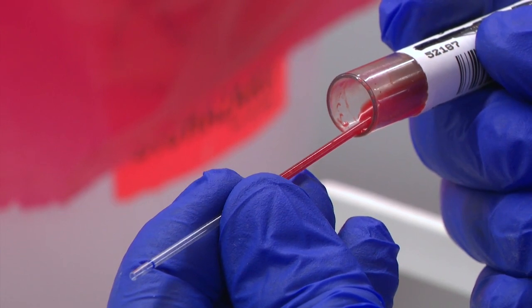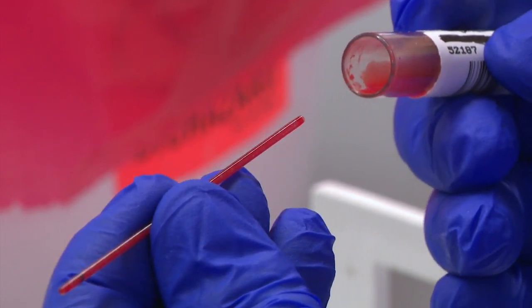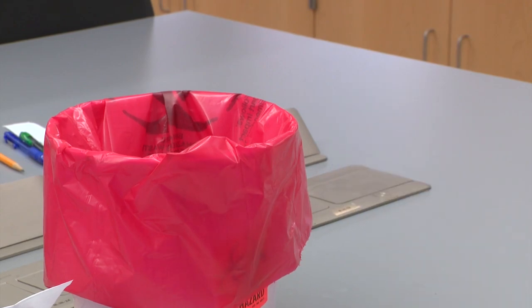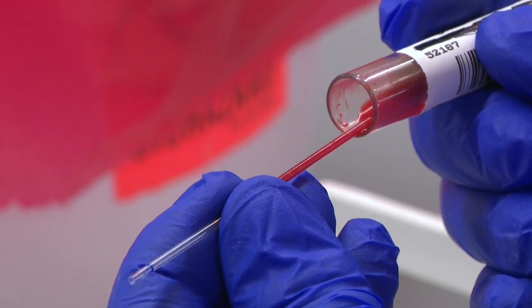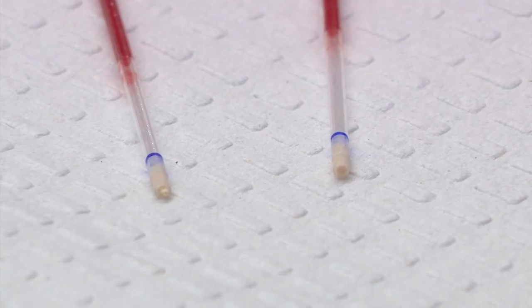If your sample runs completely through the tube so that you no longer have a dry end, discard the micro hematocrit tube and start over with a new tube. The clay should contact dry glass in order to hold blood during centrifugation. You need to be able to see a dry space in the tube between the clay and your blood sample.